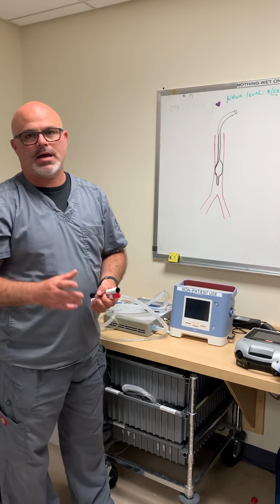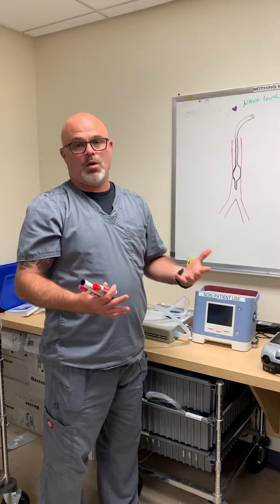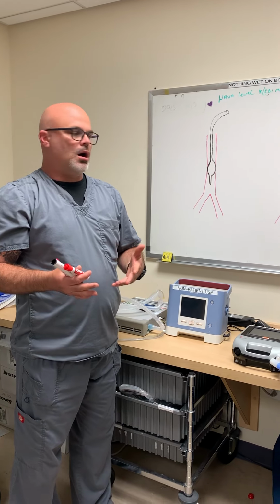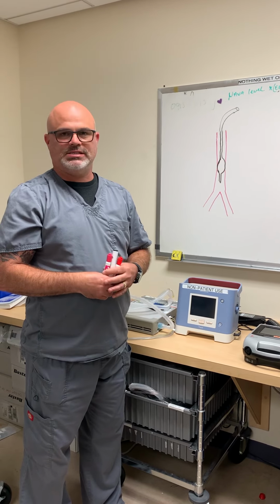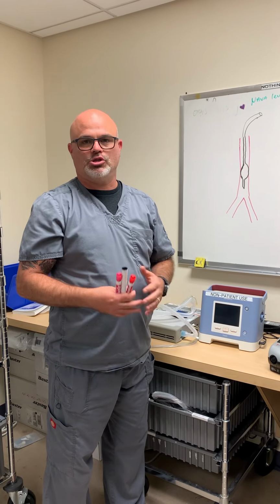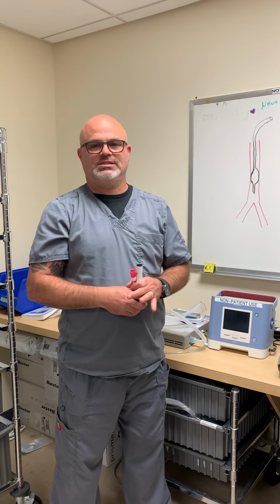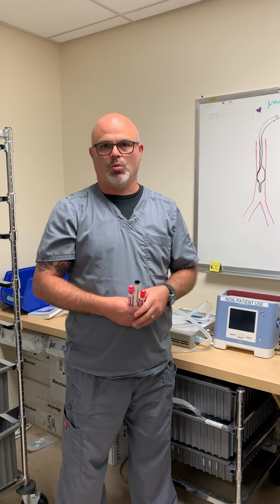Okay, today we're going to talk about leak tests and what they mean, why we do them, and how we do them. So our policy says that you have to do a leak test on your patient, determine what amount of pressure is required to seal the airway once a shift and 4 hours before extubation. Policy also says that you're to use no higher than 30 centimeters of water pressure when evaluating how much pressure it actually takes to produce a leak around the airway, which is between the artificial airway and the tracheal wall in most cases.